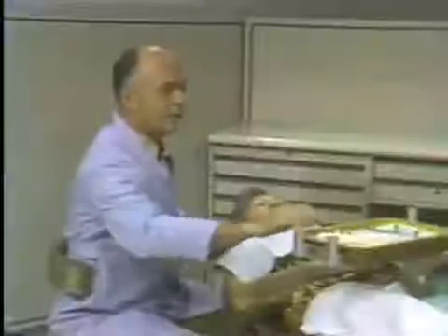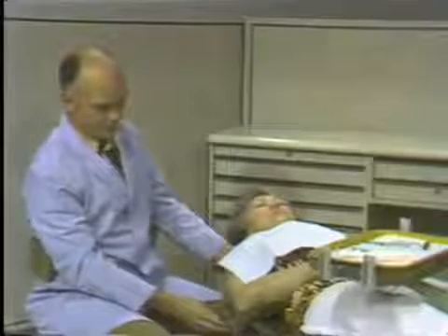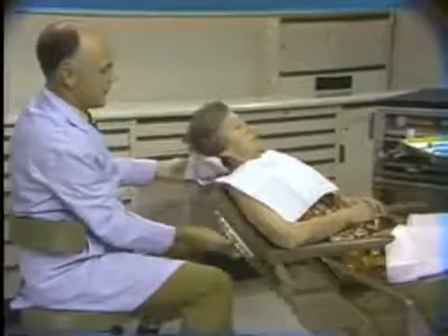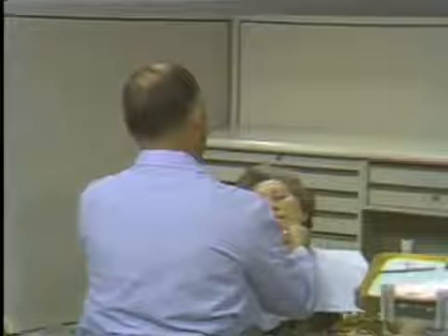The lower right quadrant is a different problem and should be treated more carefully. The chair should be in position for the lower right. You will see what I mean. Giving anesthesia in the lower right quadrant can be done with the patient in this position quite nicely.